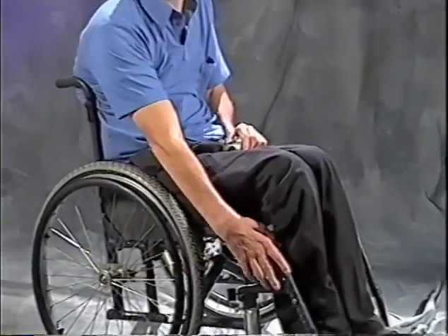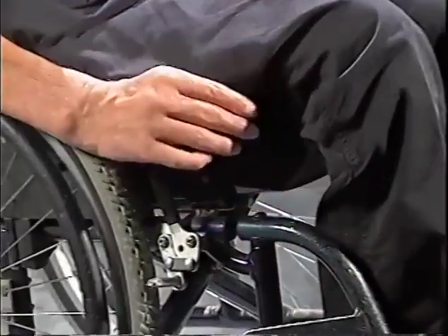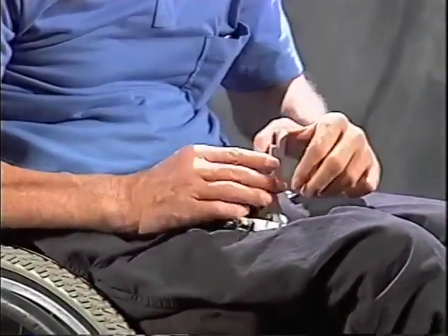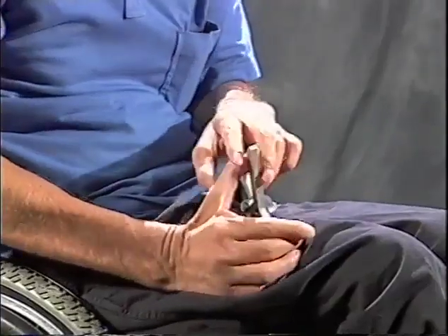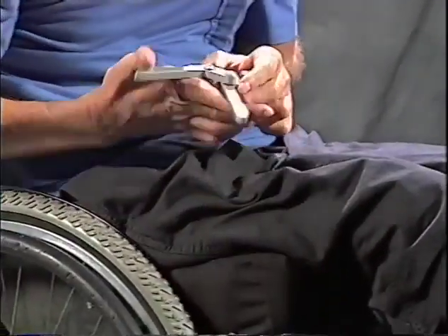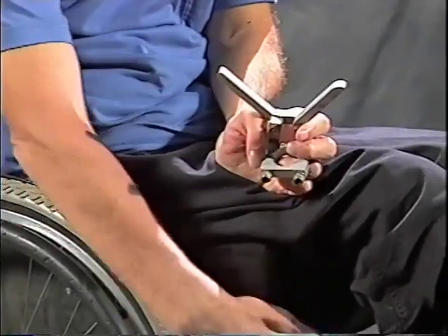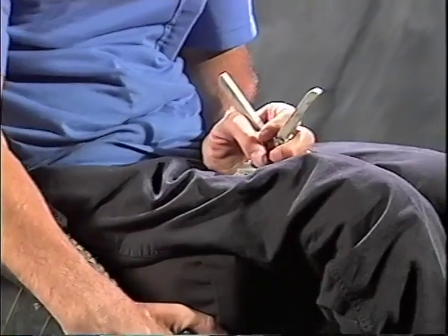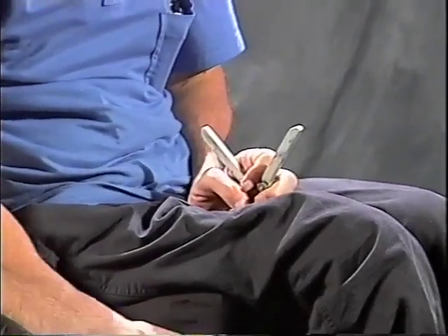There's a push brake, which locks by pushing it forward. There's a pull brake, which locks by pulling it backwards. And there are scissor brakes, which lock by sliding a scissor type apparatus. This is a scissor brake and can fit underneath the chair, so you can fold it completely out of the way without running your fingers through the brakes.